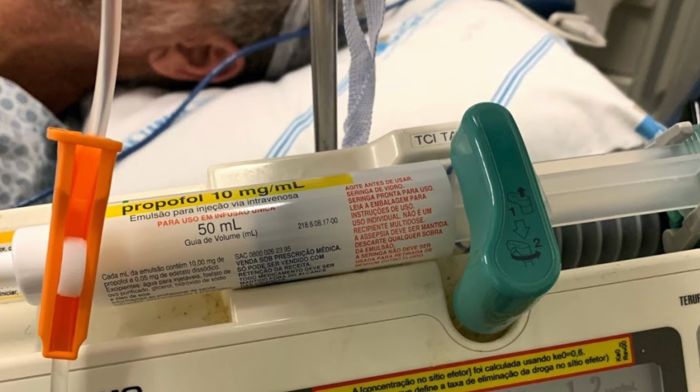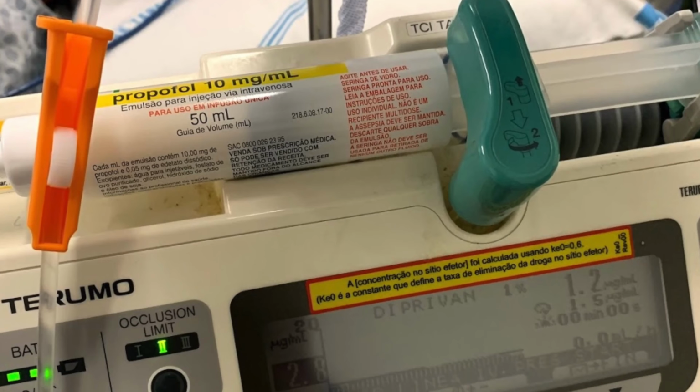Well, there are several treatments for obstructive sleep apnea, and that does not compete here in this video. Here I will talk about endoscopic sleep, which is an exam that will film the throat, the pharynx, which is where the obstructions occur. Well, how is this exam done? This exam is a little probe through the nose, with the patient sleeping, monitored, with the anesthetist on the side. He will give a medication that will simulate natural sleep.